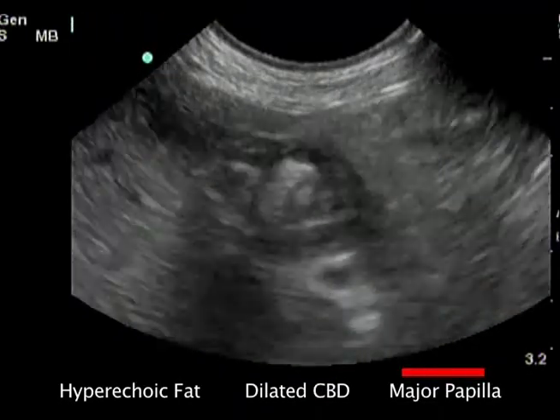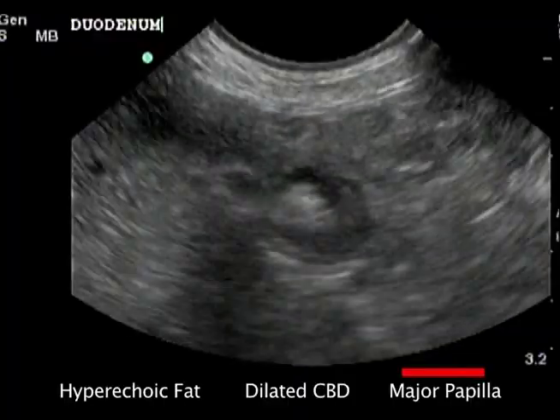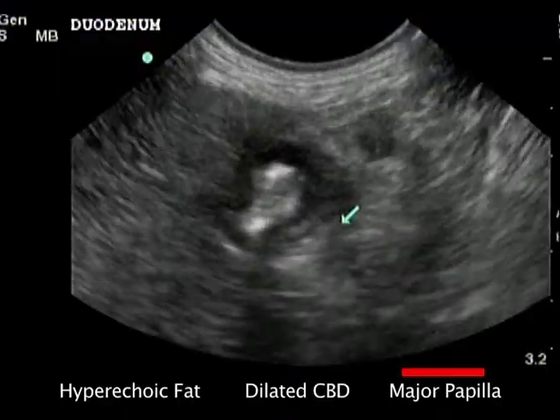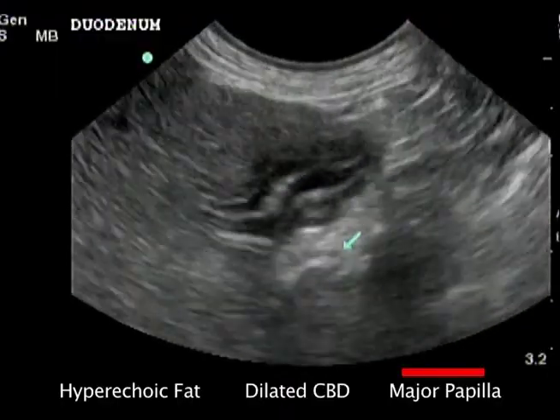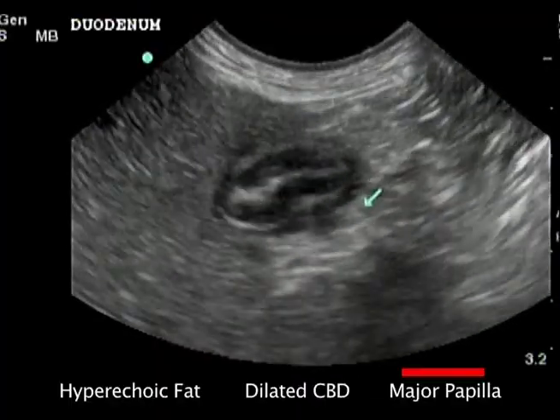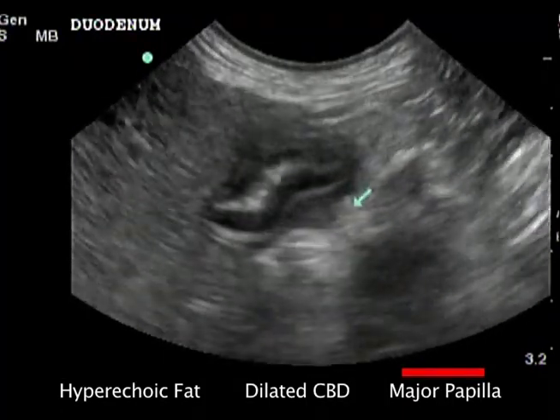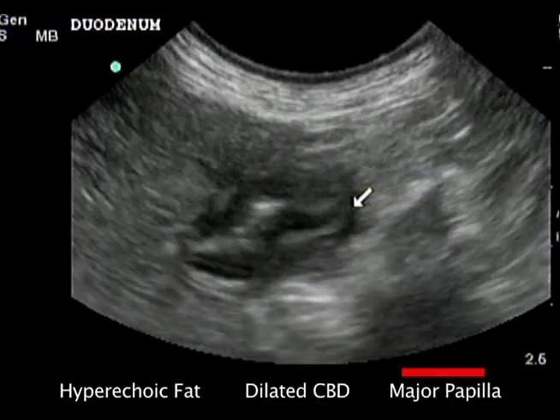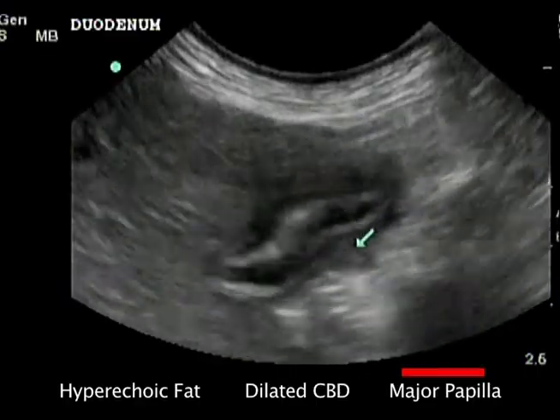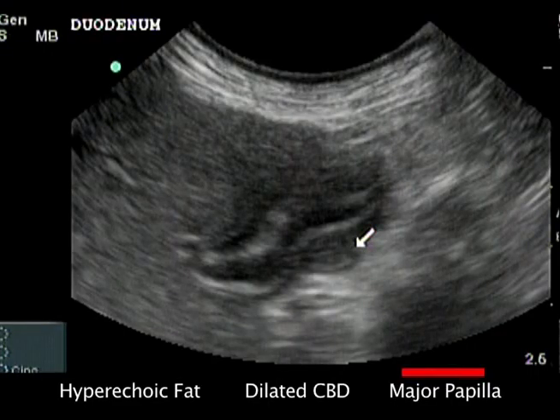In the dog, the common bile duct and the pancreatic duct connect side by side at the major duodenal papilla of the duodenum. Note the excessive duodenal contractility in this 6-year-old Chihuahua with pancreatitis. The papilla is at the dorso-caudal side of the duodenum near the pylorus. It is often possible to follow an obstructed common bile duct directly to the major duodenal papilla. With chronic inflammation or obstruction, the papilla may become enlarged or remain fluid-filled.